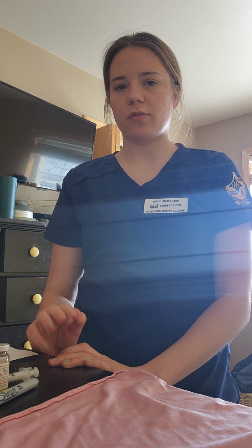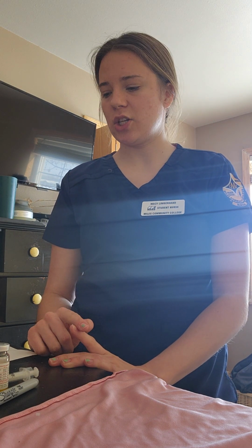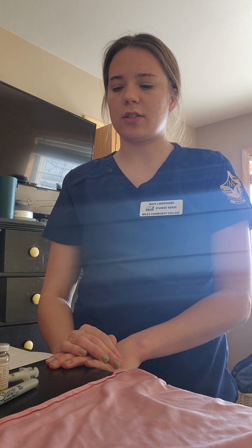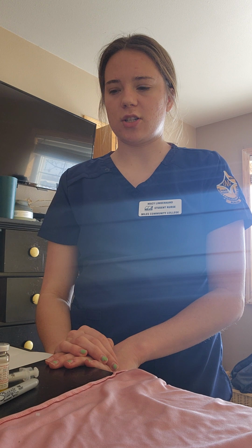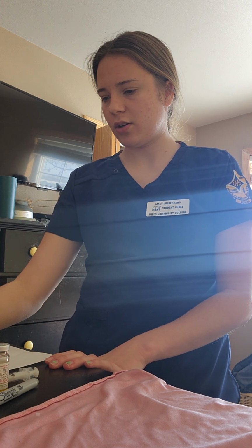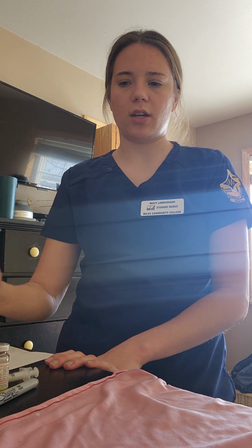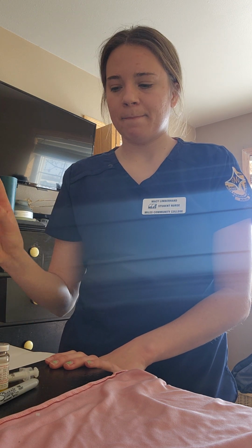Okay, now the other thing I'm going to think about before administering this to my patient is, is this a correct dose or an appropriate dose for this patient, depending on her age and her weight. After doing some research, I found out that this dose is a little low, but she does just have, I think, a mild infection, so it'd kind of be right in with that mild range. So it is appropriate.